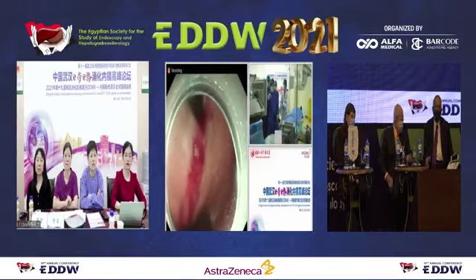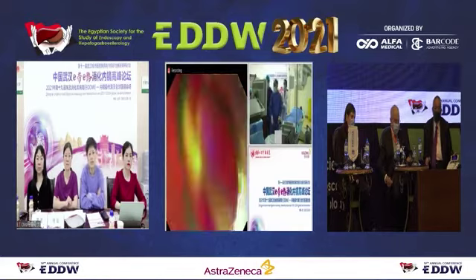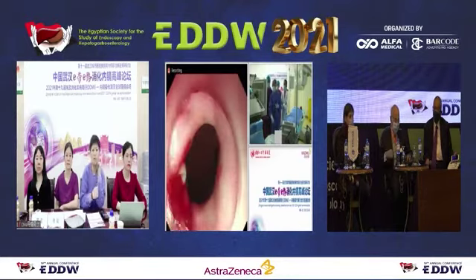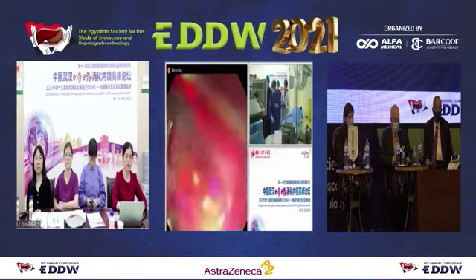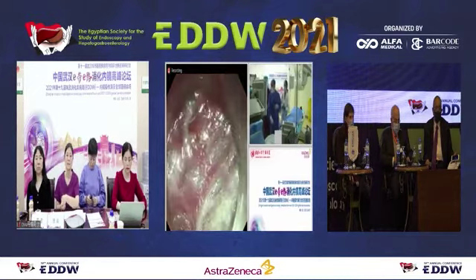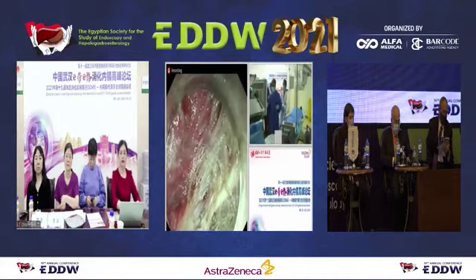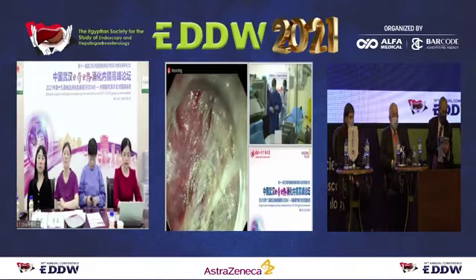When we put in the endoscope, there is no obstacle, no force. We inject a bit more and go a little further, 1 more centimeter. Yeah. Okay.